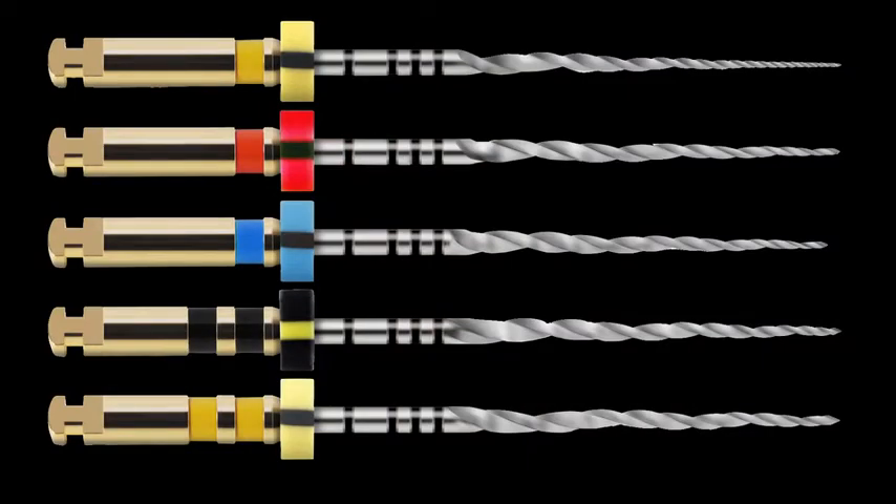The ProTaper Next files are making a difference in people's hands every day. Let me give you a quick glimpse into how they work. As with most endodontic instrument sequences, the use of ProTaper Next is preceded by the establishment of the working length and a glide path.